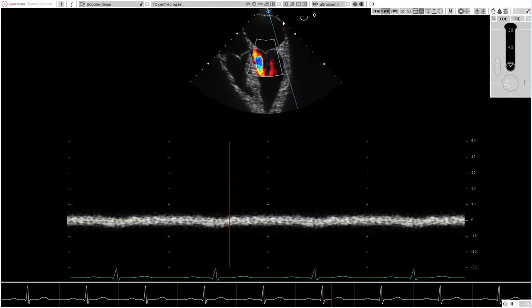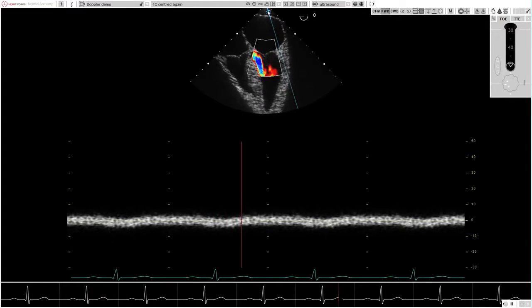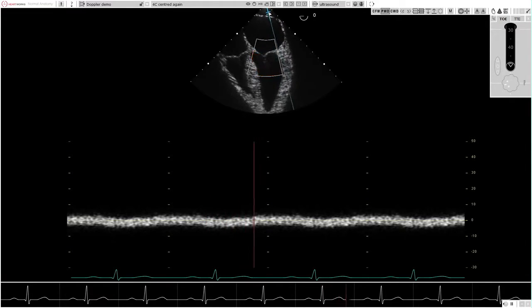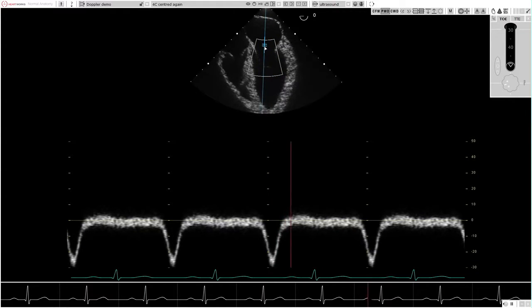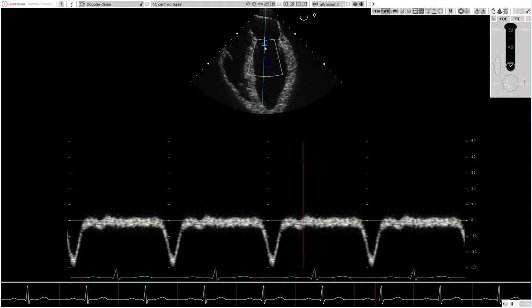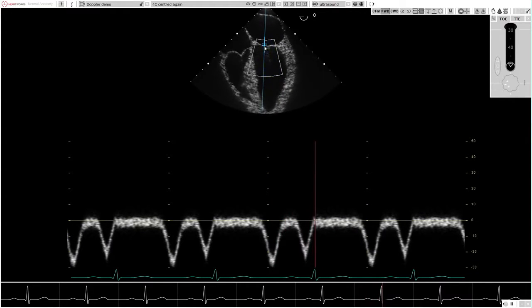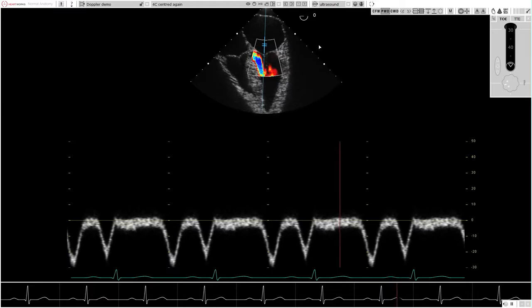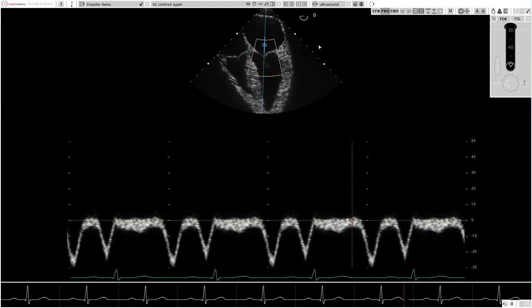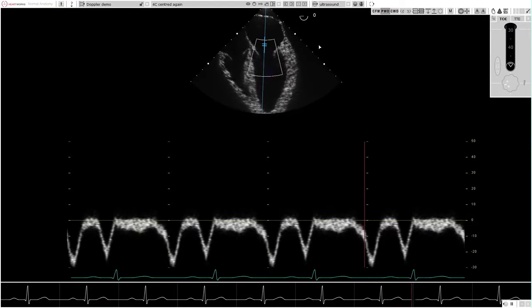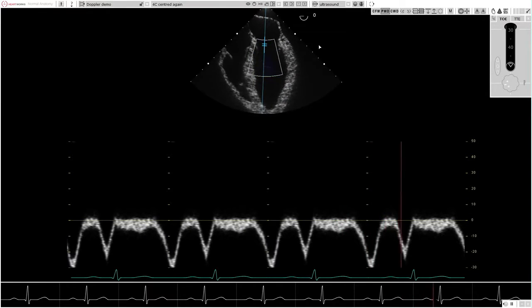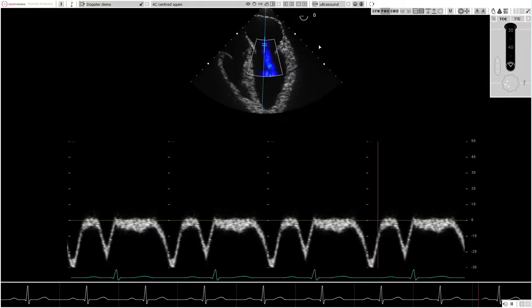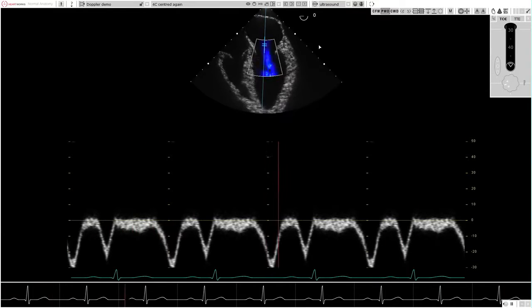Pulsed-wave Doppler imaging allows freedom to position the sample volume, allowing students to recognize the appearance of the spectral display from a correctly, as opposed to incorrectly, positioned sample volume. Small changes in sample volume position do give rise to different simulated Doppler waveforms, as in real life.